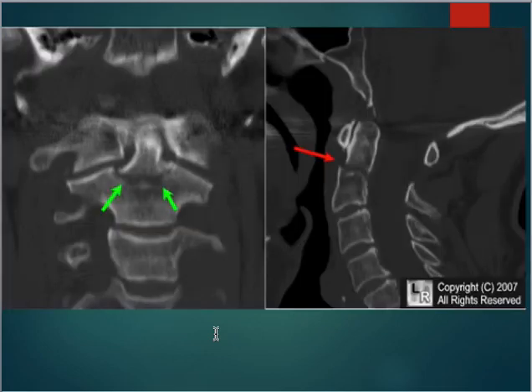This is actually a CT fracture. So you've got your coronal and your sagittal planes here. You can see right here on C2, this is C1, your dens, and then this is your C2 vertebrae, your second cervical vertebrae. There's a fracture right here that's broken off between C2 and the dens. The dens is actually what holds your head on your spine with a bunch of ligaments attached to that, and you can kind of see the fracture here too. So that's pretty dangerous. A lot of times that's from an MVA situation, trauma.